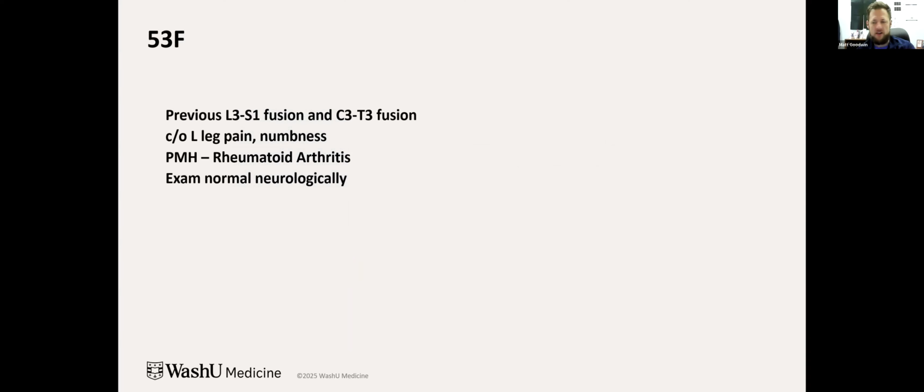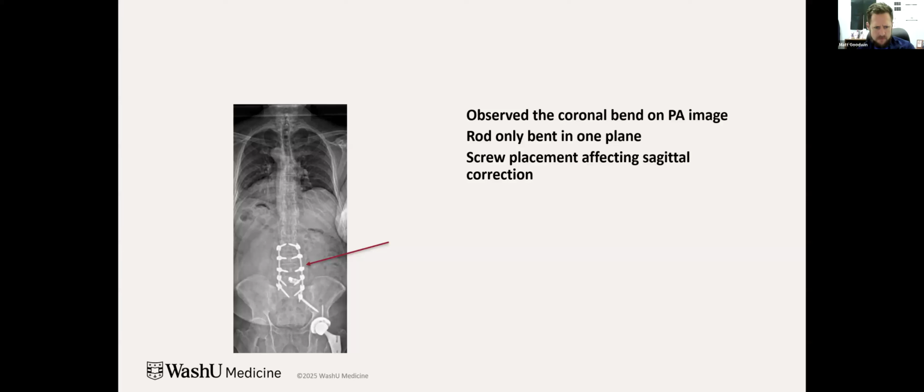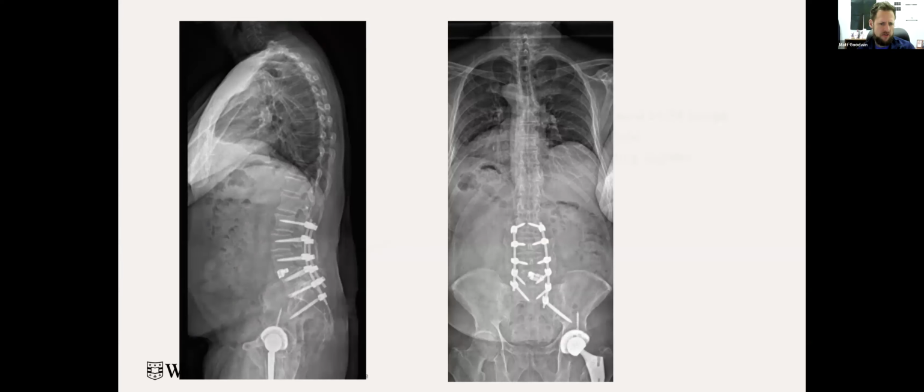Before you go to the next one, that last case, is this on the Pro-axis bed? And then I was wondering if you would just talk a little bit about your thoughts on using these rods and how easy they should be to put in. Meaning, should you have the correction you want and be able to lay the rod in there? Are you pulling the rod down some? Do you know what I mean?